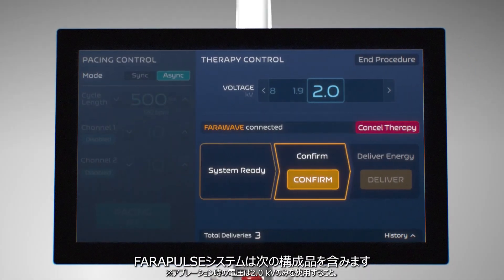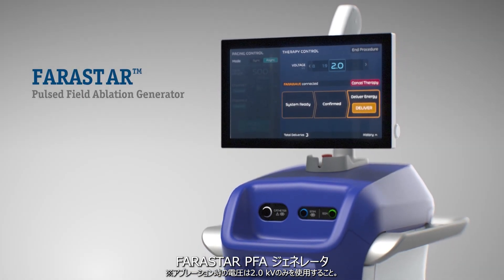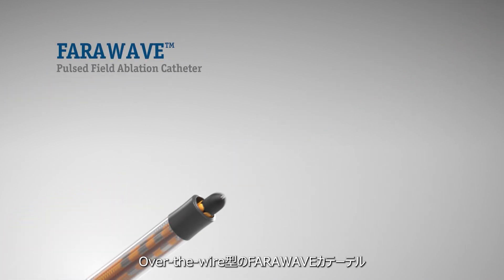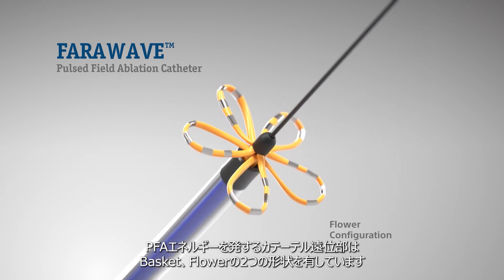Built from the ground up, the Farapulse PFA system is comprised of the Farastar Bipolar and Biphasic Waveform Generator, Faradrive Steerable Sheath, and Farawave Over the Wire PFA Catheter with adaptable distal shapes to treat a range of pulmonary vein anatomies.